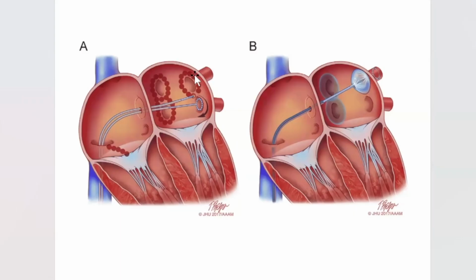There are lots of different arrhythmias, lots of different reasons to do it. In some cases, there is a clear abnormal electrical circuit that we map, we look for it, and we zap it. In atrial fibrillation, it's very anatomical. We go into your heart and we want to electrically isolate the veins that drain blood from your lungs into the heart. Some of the time we want to isolate the area between the veins. We call the back wall or the posterior wall of the left upper chamber.